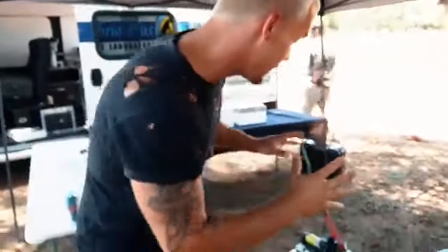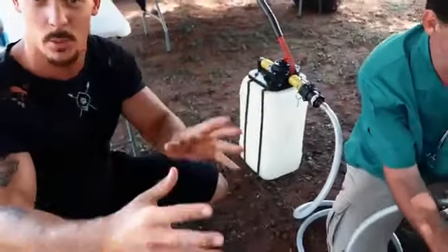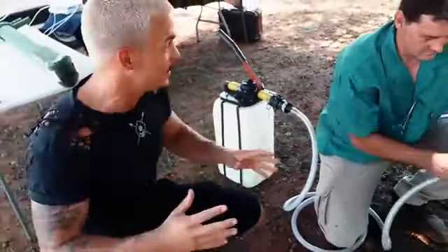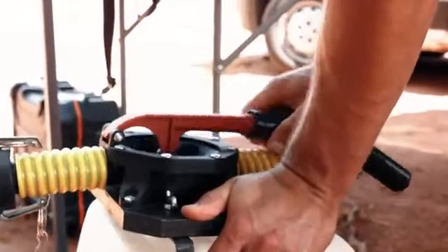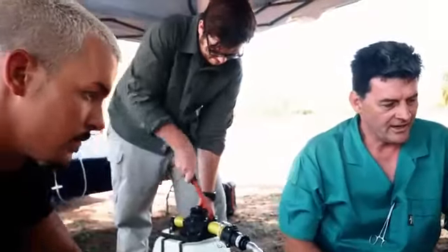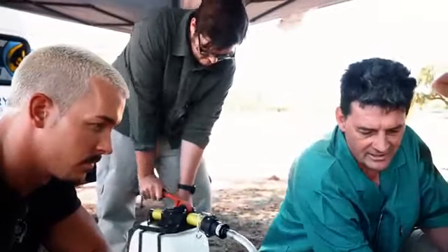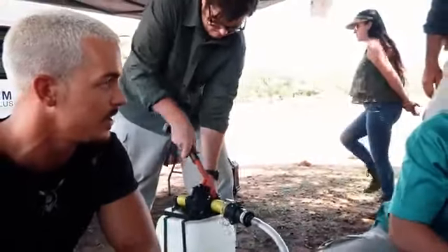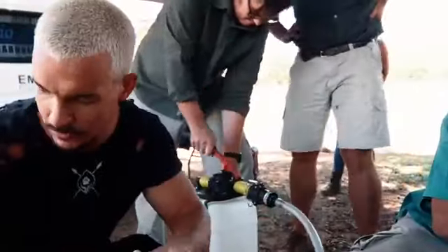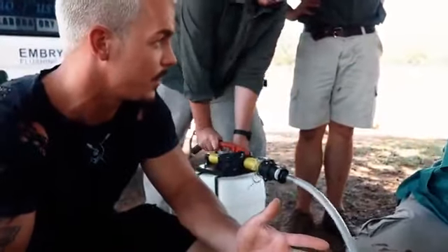90% of the tools which you guys will see today are custom made by Dr. De la Ray. So this is basically a pump they're using. The idea is we need the rectum to be flushed out so that all the bacteria or whatever is there will be removed, giving a clean foundation to work on. These guys are game changers.